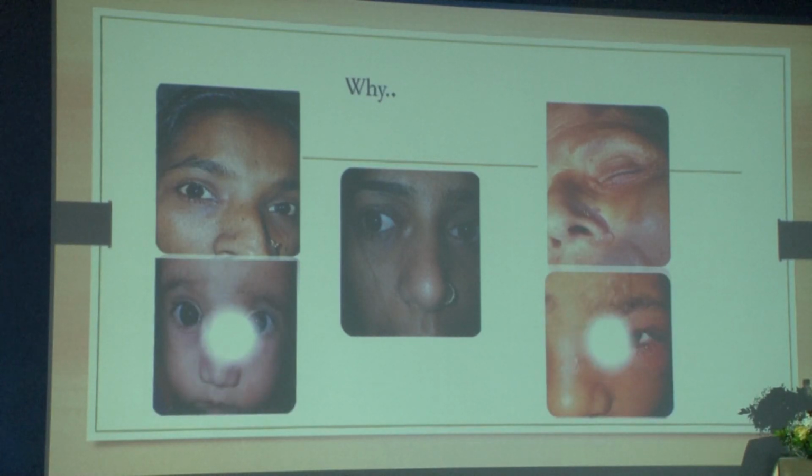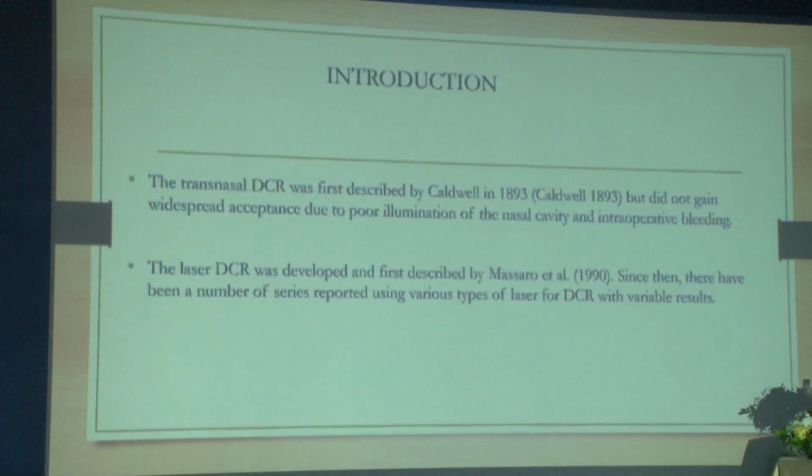Another young child presented with bilateral mucocele, and another patient presented with acute dacryocystitis and preseptal cellulitis. So different cases have different problems, and we have to think according to the problems. That's why there is a need for multiple different approaches for management.